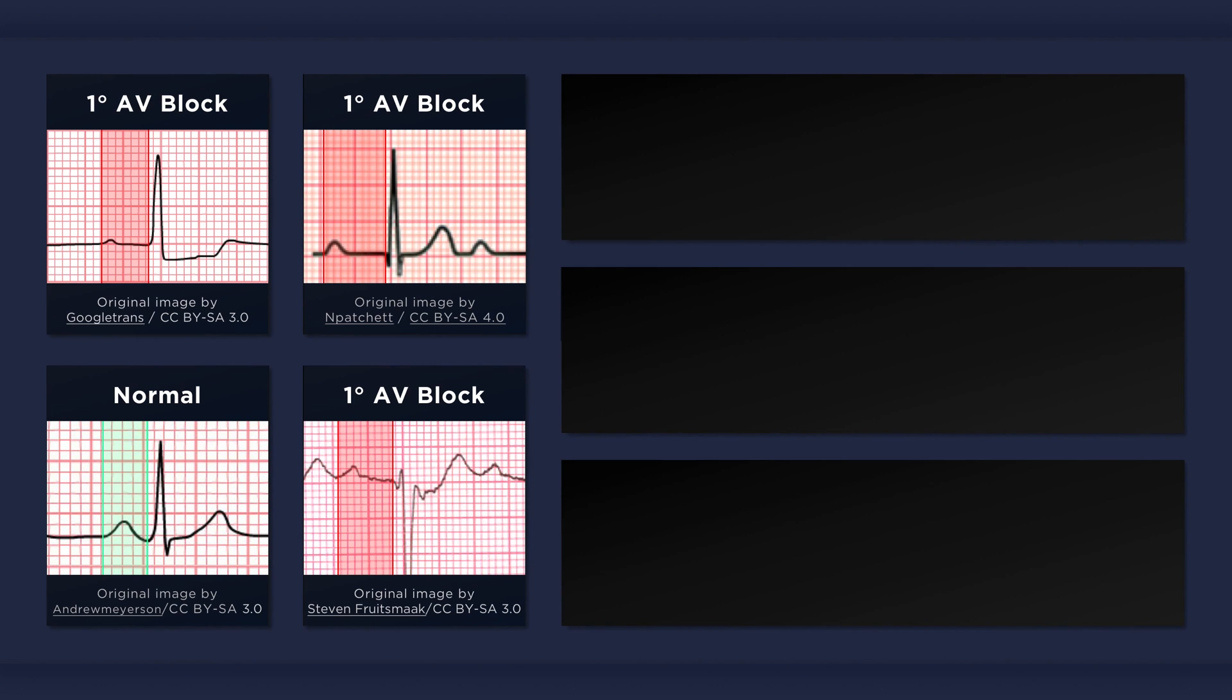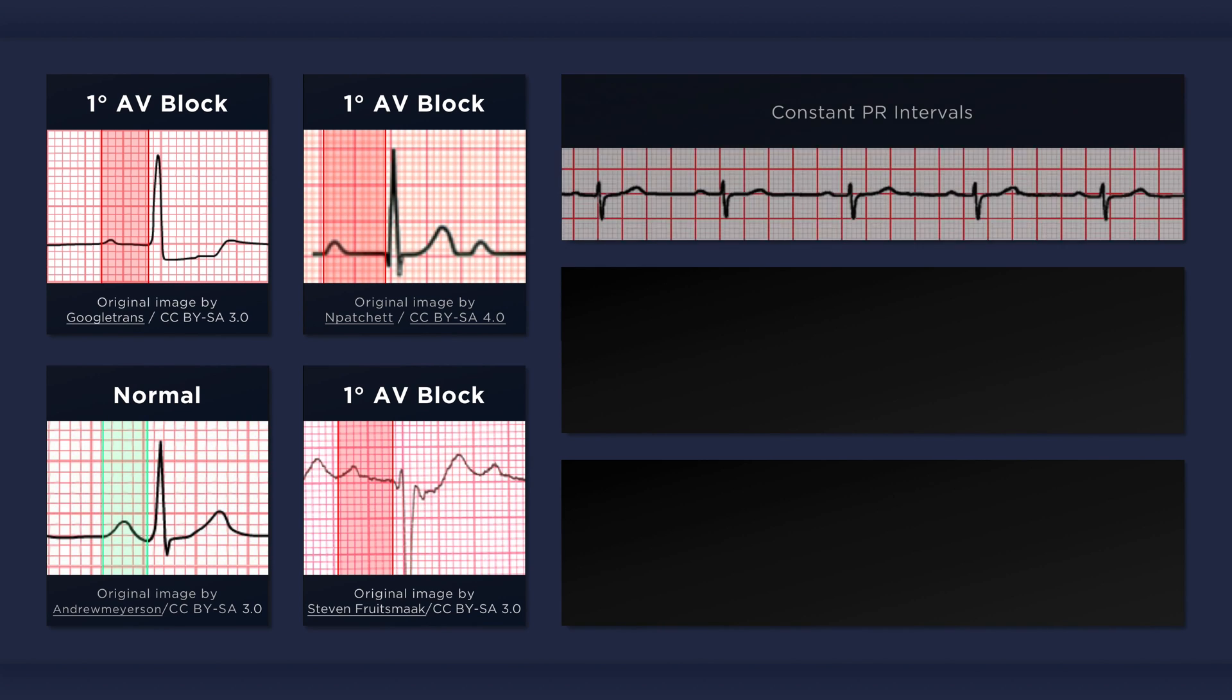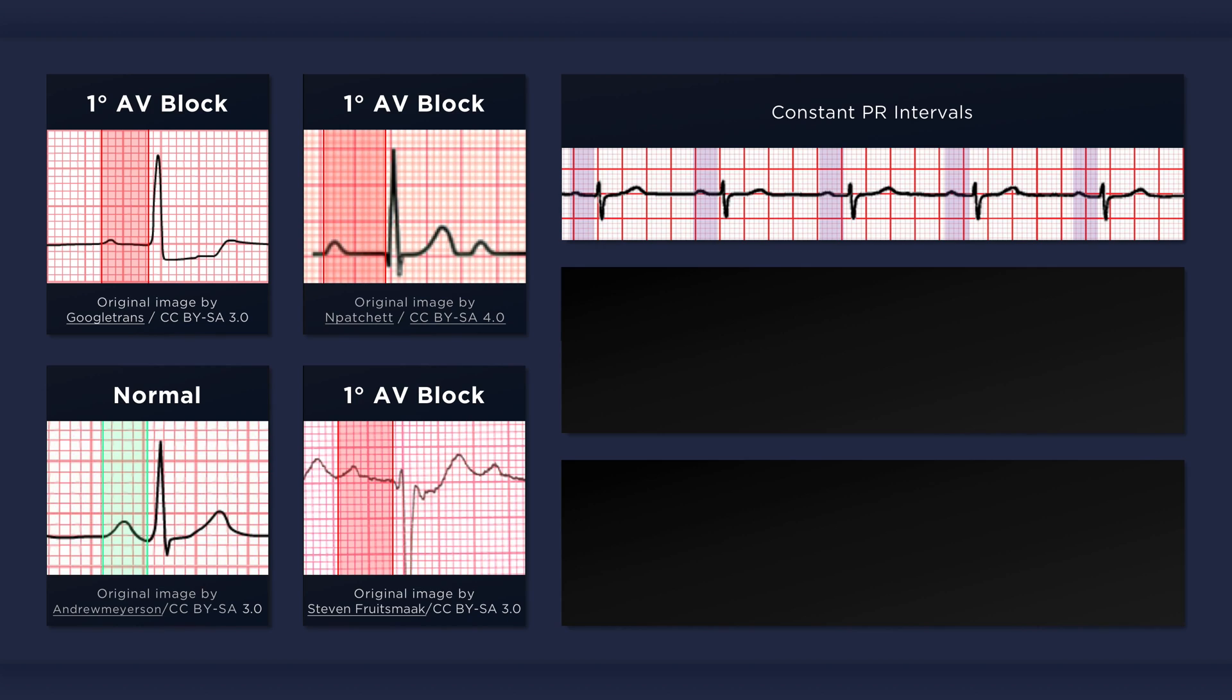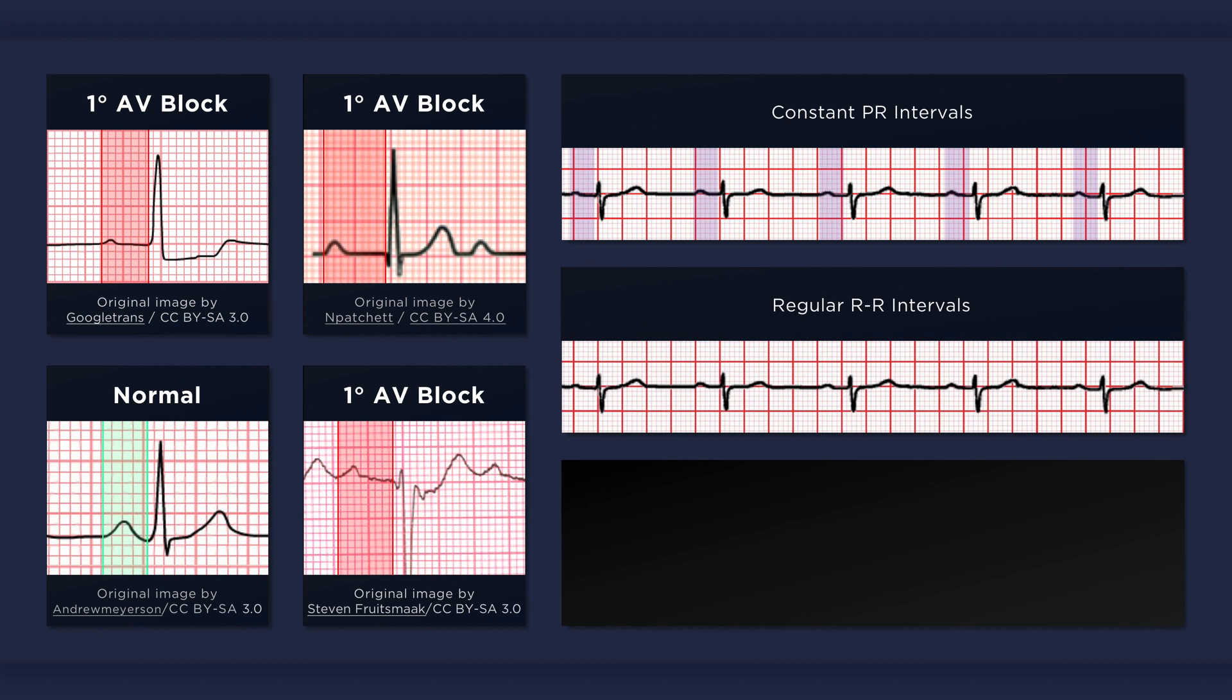Now there are a few more features of first degree AV block which are worth paying attention to. While the PR interval is prolonged, it does not vary from beat to beat. Lengthening of successive PR intervals followed by a drop beat would be indicative of type 1 second degree AV block. The heart rate is dependent on the underlying sinus rhythm and is not usually affected if first degree heart block is the only abnormality present.